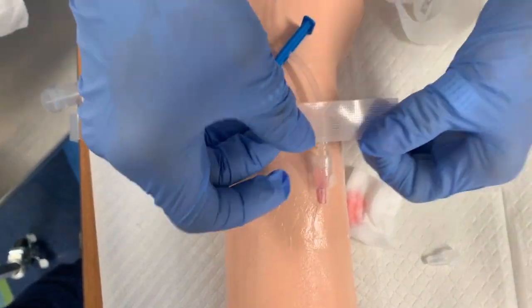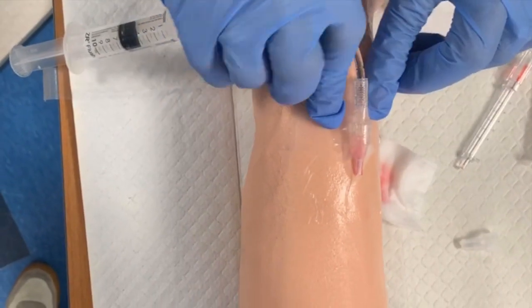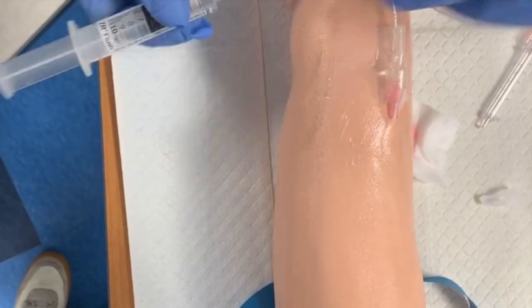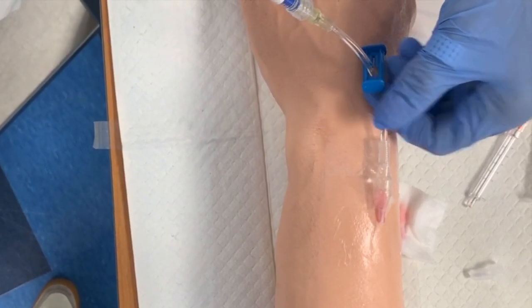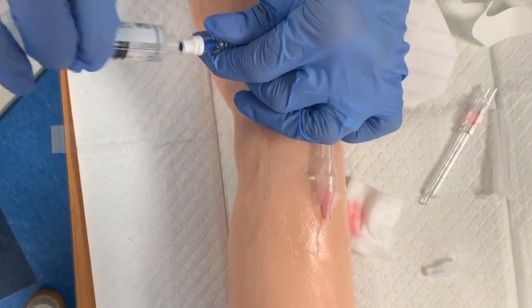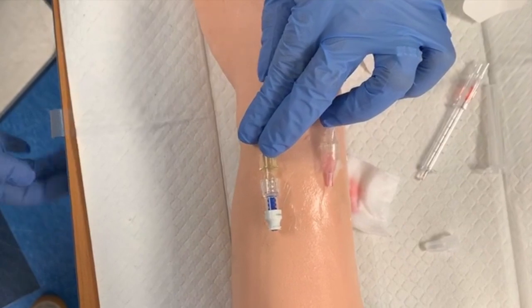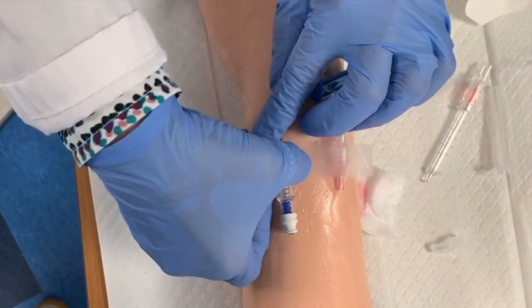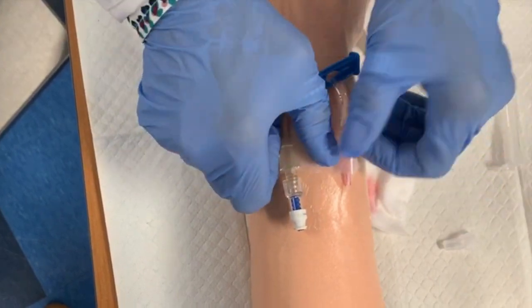And then I take my second piece of tape and I come over that top edge to seal it. So make sure it's nice and secure, and then I always like to give one more little quick flush, because sometimes you can dislodge your catheter during the securing of it. So disconnect that syringe, and now we want to secure our hub. And I like to tape it kind of back like this so it doesn't occlude my site. My tape doesn't go over the site.